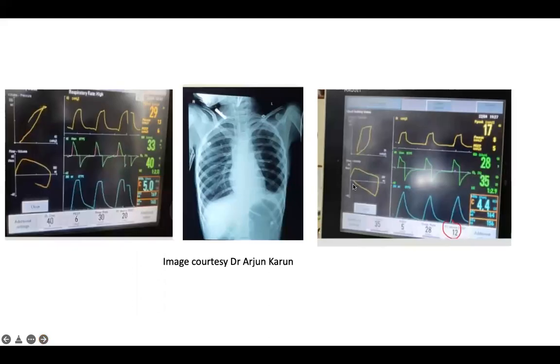This is another patient, same scenario. You can see here what has happened. Here, the PEEP is high and the pressure support above PEEP is also kept at 20, because of which the compliance is very low and almost there is a beaking happening there. And X-ray is showing hyperinflation. This was in fact a medical patient.